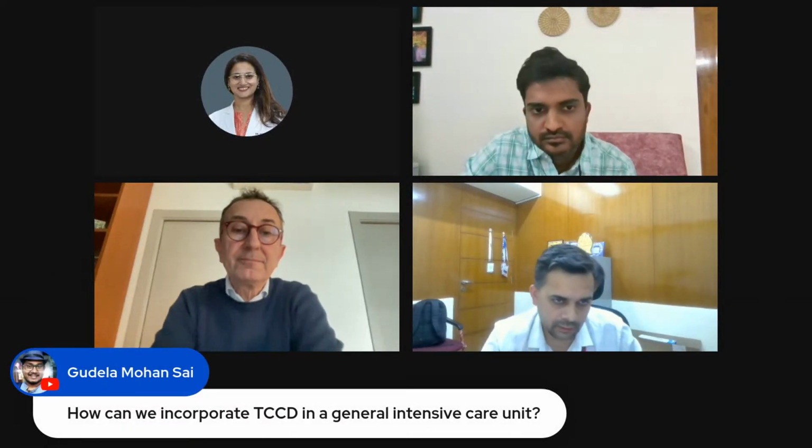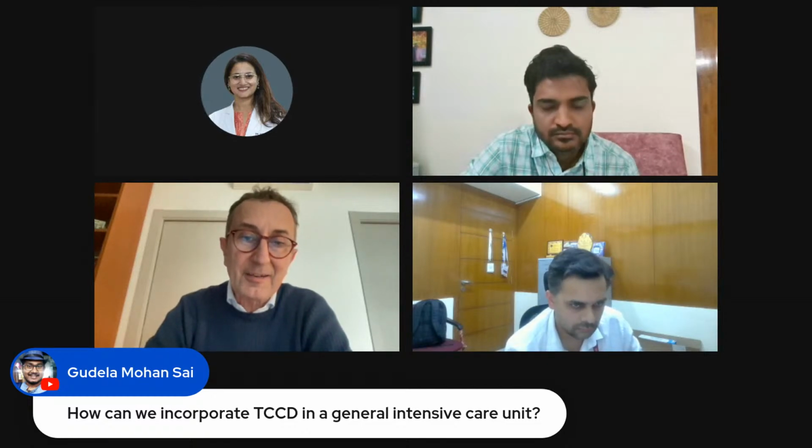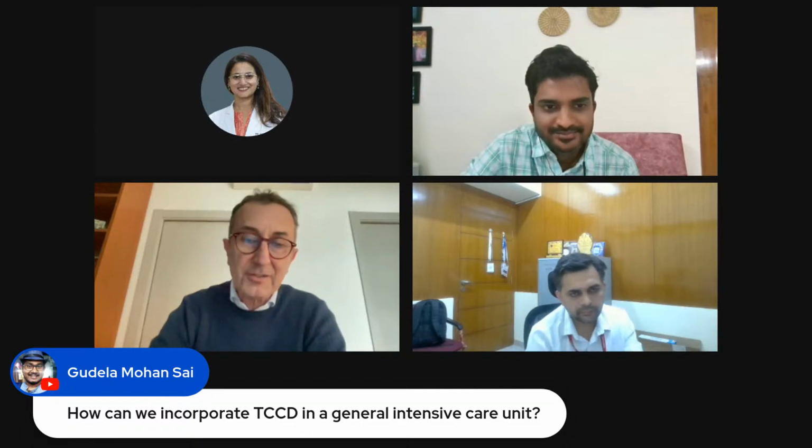In ICU? In general, yeah. In general critical care or something? But TCCD is a good choice for a clinic, for a neurologist, for an intensivist, and also for other specialists.